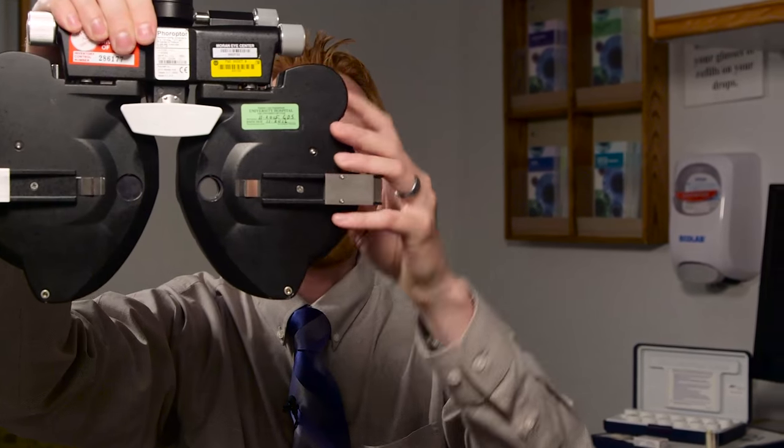What's very, very important with the gas permeable contact lens is after it's settled down to do an over-refraction. Over-refraction is vital with GP lenses because that's really the only way to know what power of contact lens to order. In this patient's case, the contact lens's power is a negative 3.0. I can do an over-refraction to determine what the ideal power would be for this patient with the base curve of 44.25.